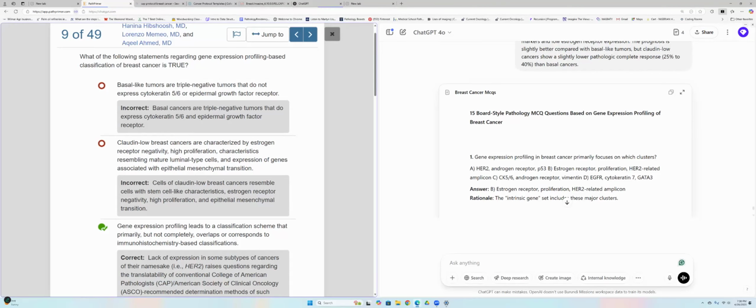I've not started practicing in the UK. We use paper in Nigeria. Here we don't use paper. The photographs will be uploaded immediately to your laboratory information system.